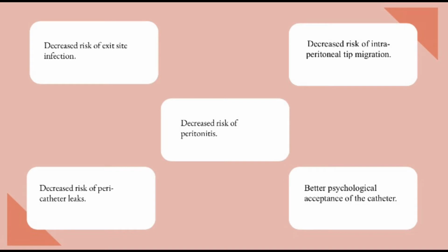And what are the advantages of the pre-sternal swan neck catheter? As I mentioned, it has a decreased risk of exit site infection, decreased risk of peritonitis, decreased risk of intraperitoneal tip migration, decreased risk of pericatheter leaks, and better psychological acceptance of the catheter.